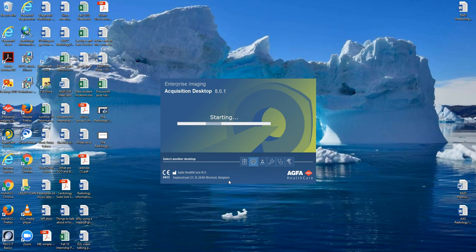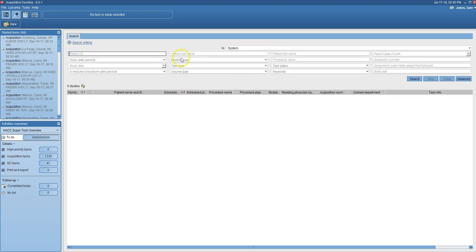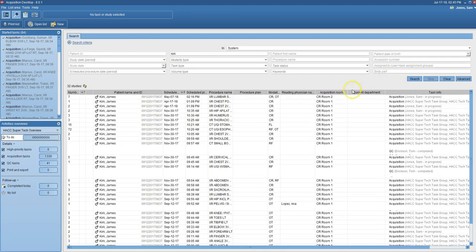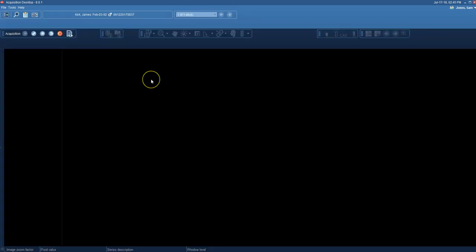Click past the launch screen and PACS will open to a task screen — we don't want to do anything with the task screen. Come up here and click the magnifying glass to open the search window. I'm going to look for James Kirk, so in the last name field I'll type Kirk, then click search. There are James Kirk's exams, and I'm interested in his back.